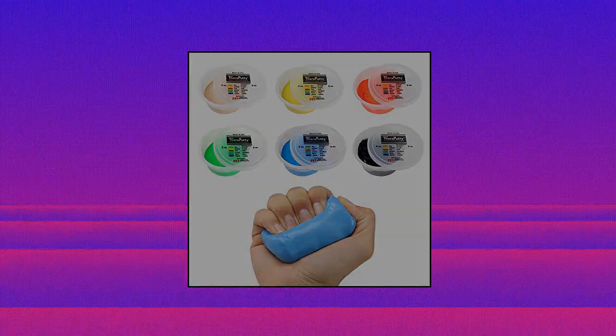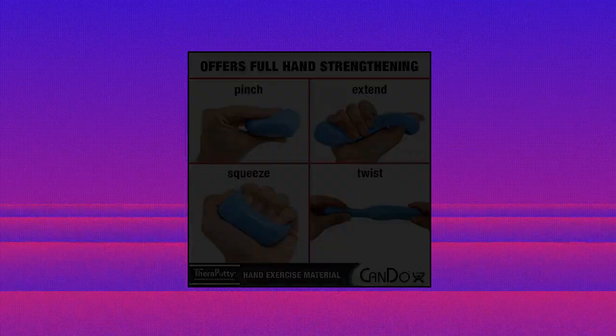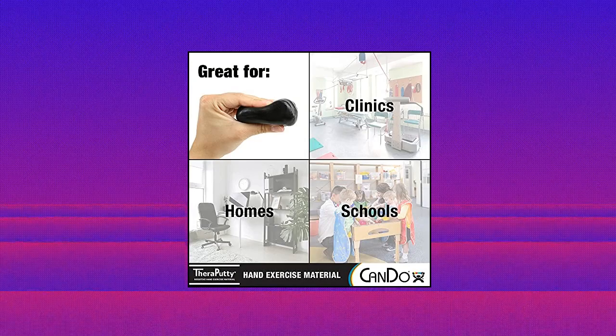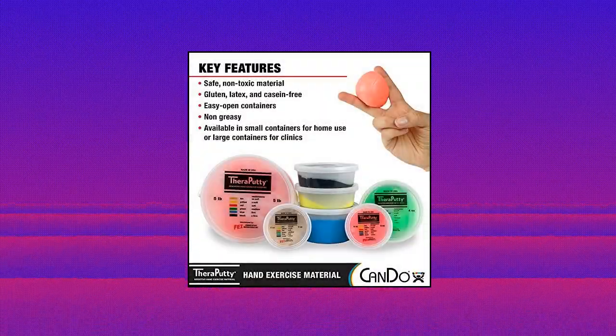Can Do Thera Putty standard hand exercise putty for rehabilitation, exercises, hand therapy, and active recovery for climbers. Available as a six-pack of putty, varying from super soft to super hard.